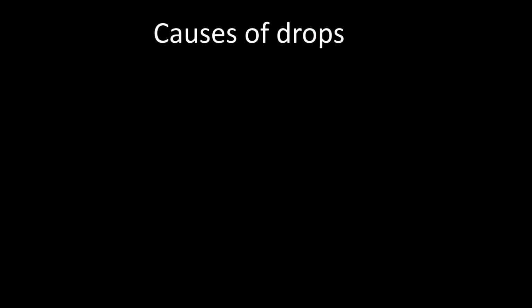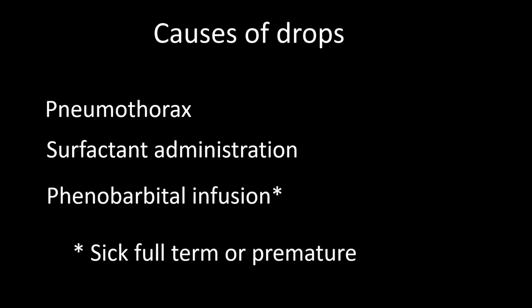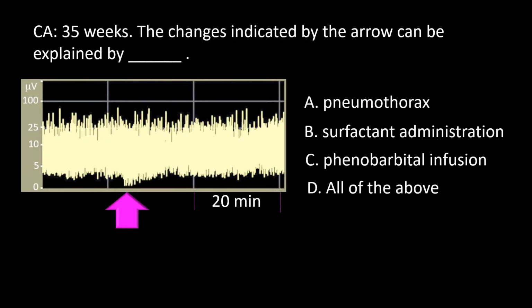Frequent causes of background drops are pneumothorax, surfactant administration, phenobarbital infusion in sick full-term or premature neonates. So the answer to this question is D, all of the above.